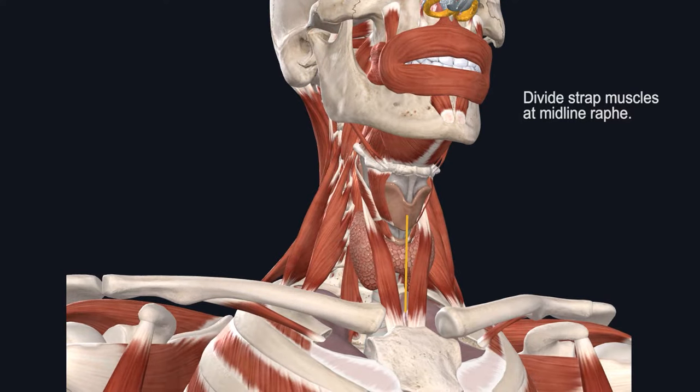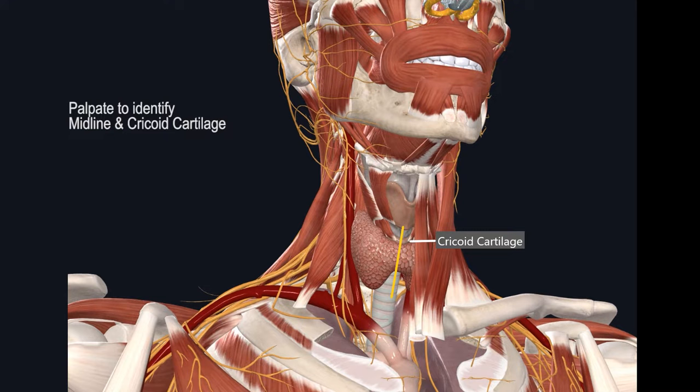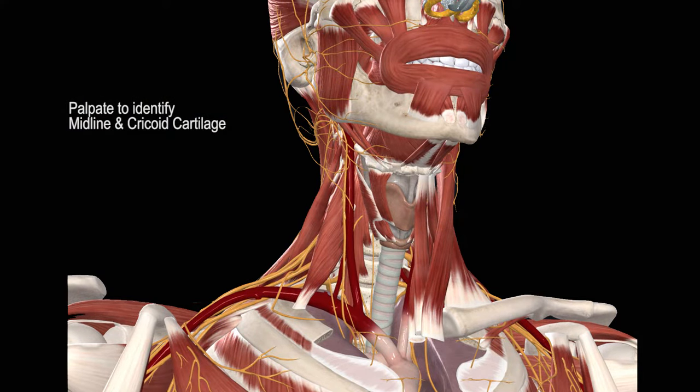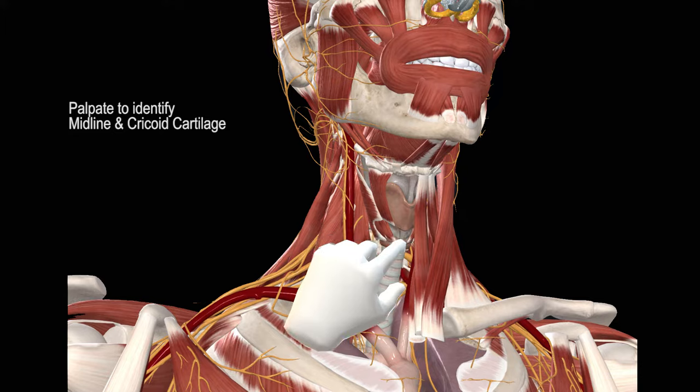Once you separate the strap muscles and approach deeper structures, it becomes critical to identify your midline and the cricoid cartilage. You can achieve this by first palpating for the thyroid cartilage, which is quite prominent in most patients. Follow it inferiorly until you feel an indentation where the cricothyroid membrane exists. This also marks the midline reference point. Immediately inferior to the indentation will be your cricoid cartilage, and at its inferior margin there'll be another step-off where the first tracheal ring starts.